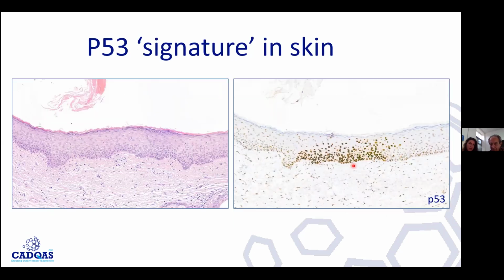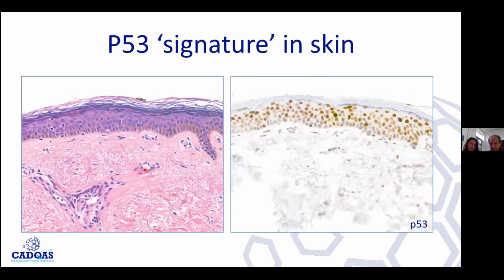Yeah, exactly. And I just want you to know that the epithelium is normal. And here is a bit of inverted staining. Now, there have been wild type patterns that spare the basal layer completely, but this is almost all cell staining. So this is between a P53 signature and an odd wild type pattern. At the same time, there is no evidence of dysplasia or reactive changes that would explain overexpression.